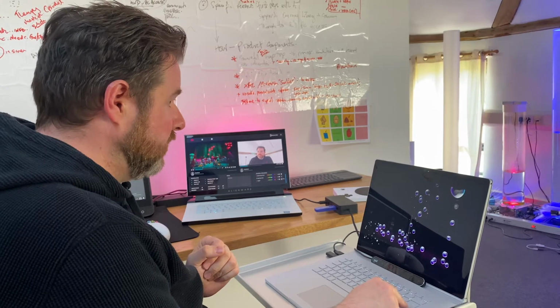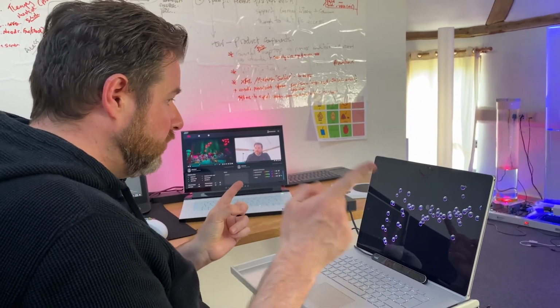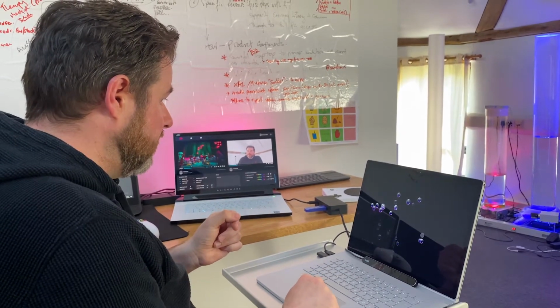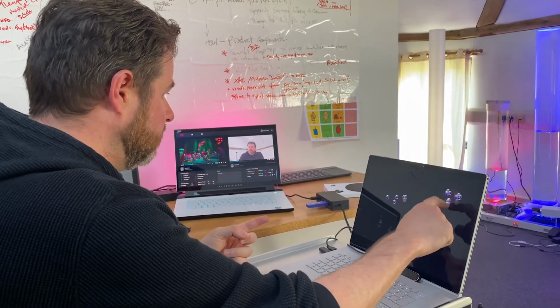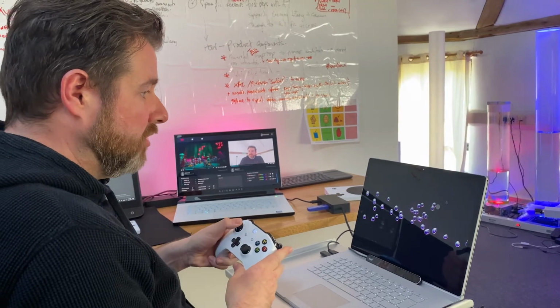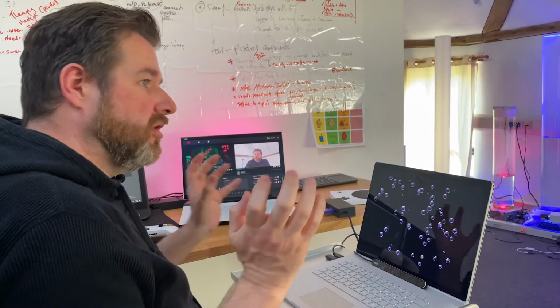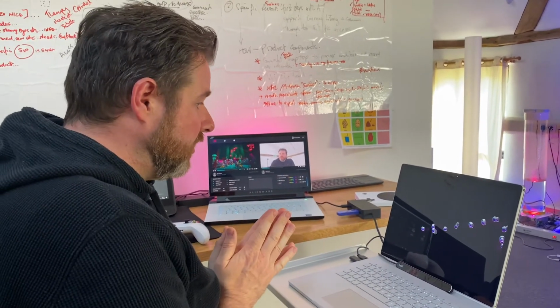And obviously, being a completist, I need to actually get rid of all of them. We still have all the concurrent access methods. So obviously over on the left, I have my eye gaze. I can bring in a mouse cursor over here. I can switch that up for touch input if I was going to do that. And I can also still use game controller input as well. So we always have 4 concurrent inputs to enable different people to interact in the scene at the same time.